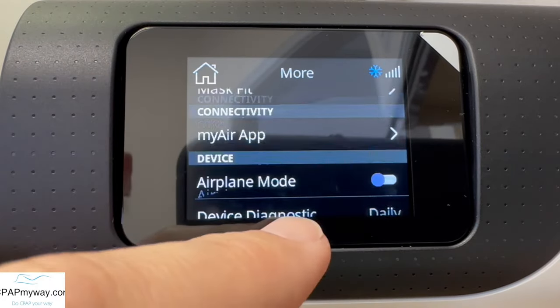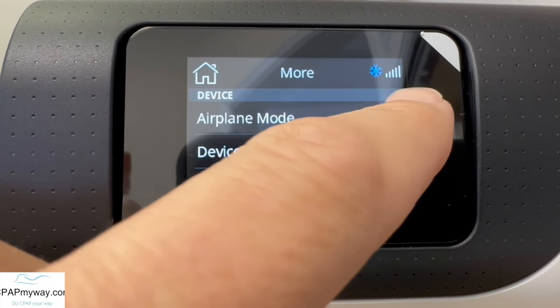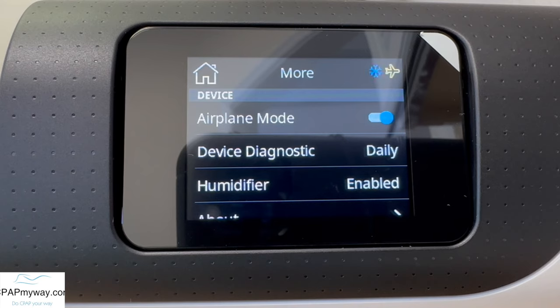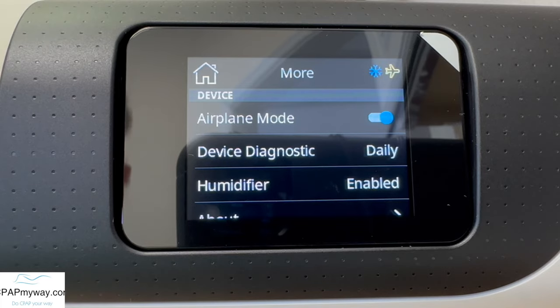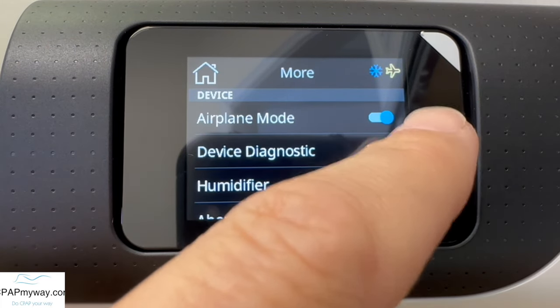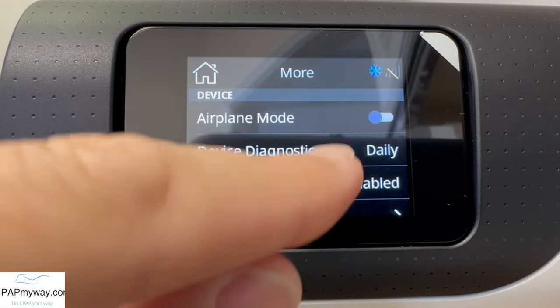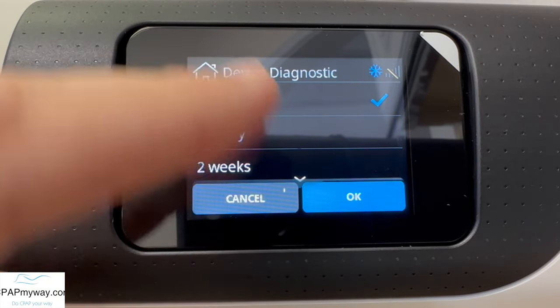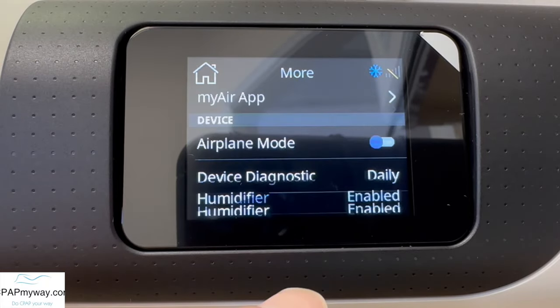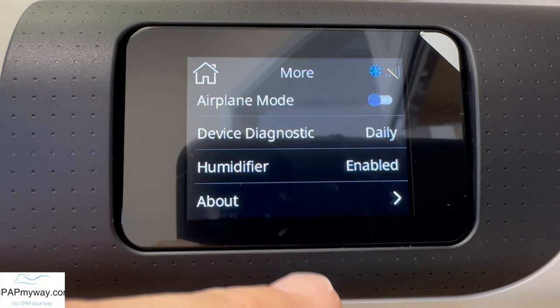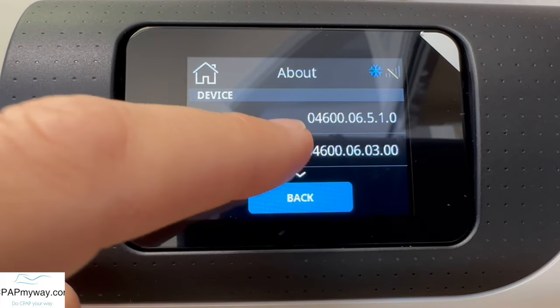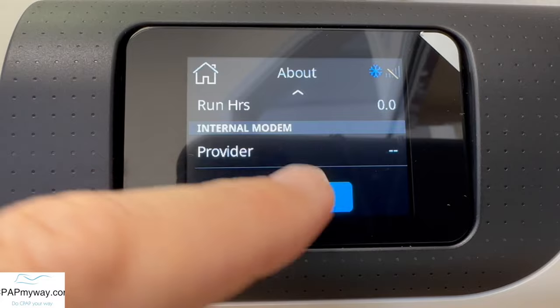You can also find some information about the MyAir app. Airplane mode would disable the modem inside, so if you were using it on an airplane you'd want to do that. Additionally, if you don't want the machine to automatically relay your information, turn airplane mode on. If you turn airplane mode on, nobody will have access to this machine — so if you need compliance reporting, you definitely want to leave this off because your supplier is going to need to take care of that. It'll run a diagnostic daily. You can change that, but I don't know really why you'd want to. Humidifier enabled is also shown there, along with device information and hours.